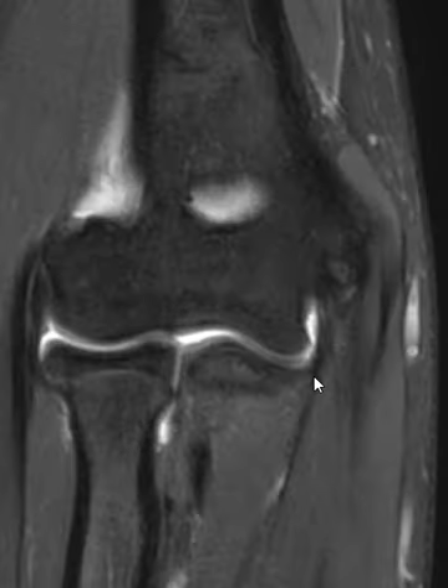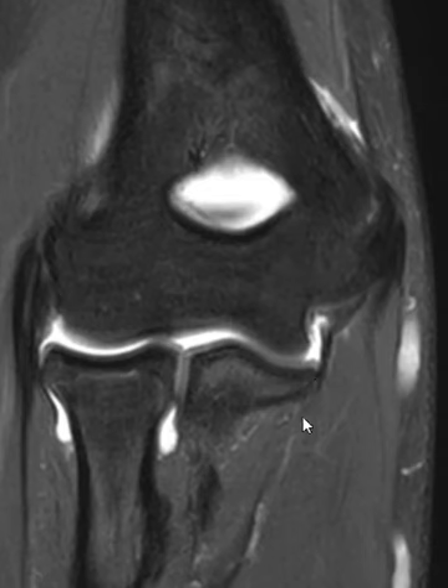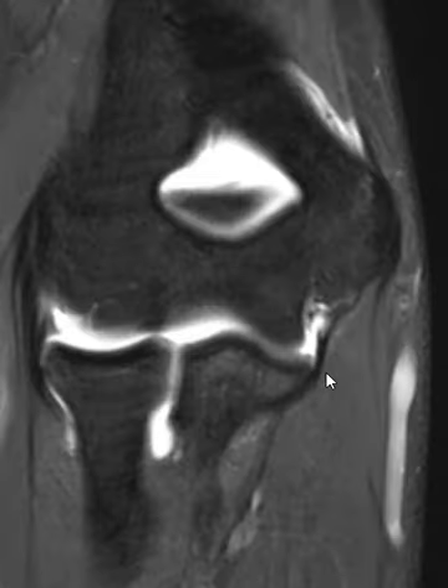If we go anteriorly, we see the anterior band of the UCL — vertical like this, comes down thin — and where it attaches here on the ulna, it looks pretty good. The bone wraps around, you can see the articular cartilage, and there's no fluid extending between there. Going back one more cut, it still looks pretty good.